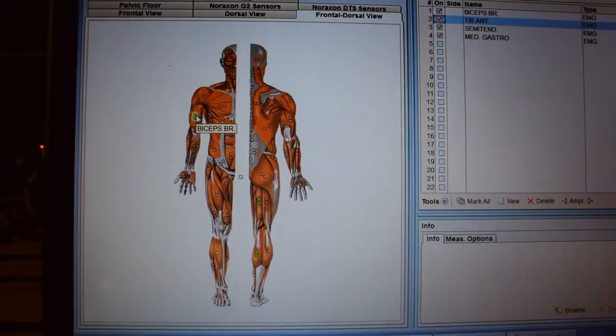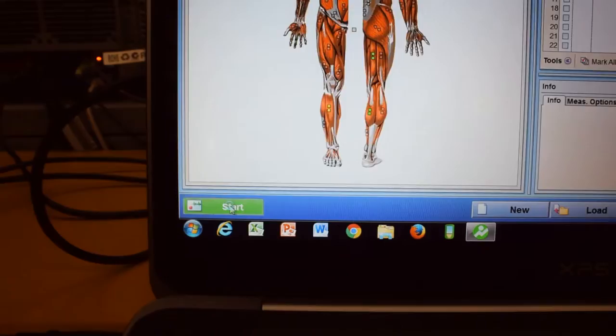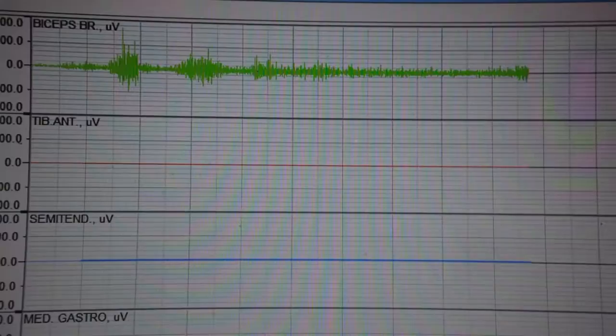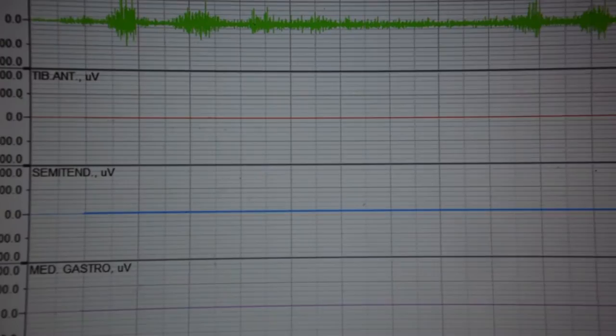So we have already selected our first channel to be on biceps brachii. Now we will come down and we will click the start button. And you will see that top graph, when I contract my arm, we get increases in muscle activity. Which is exactly what we are wanting to see.